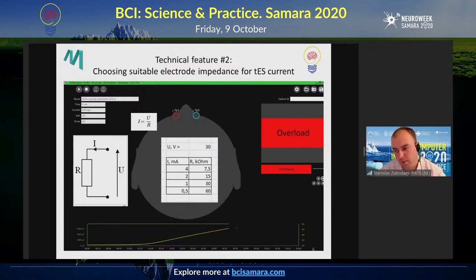Therefore, there will not be a tight contact between the electrode and the skin, which in turn will lead to a change in local current density. Let's say if a cotton sponge dries at its edges, it will not be very comfortable for your patients. Transcranial electric stimulation is sometimes reported to cause a prickling sensation in patients.